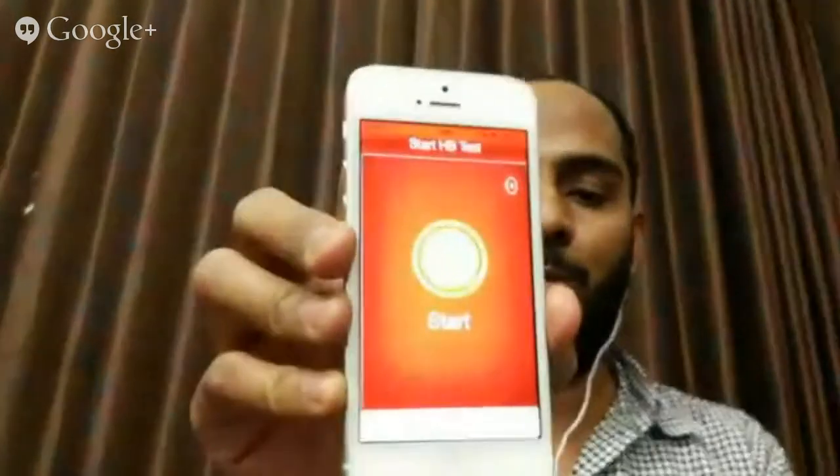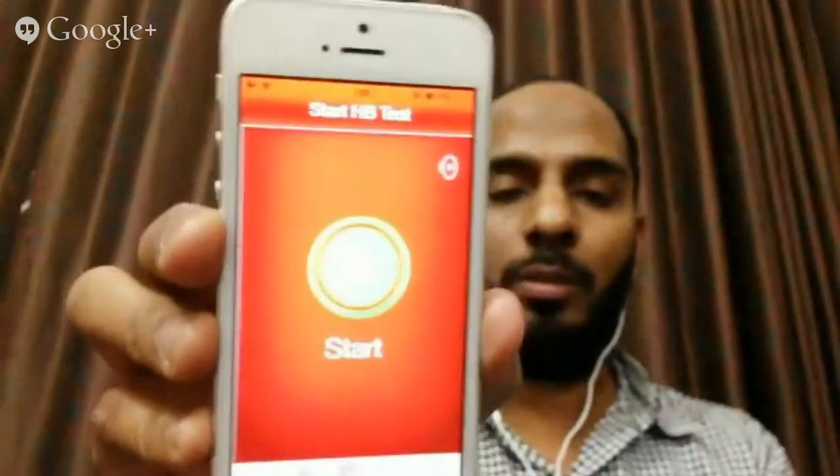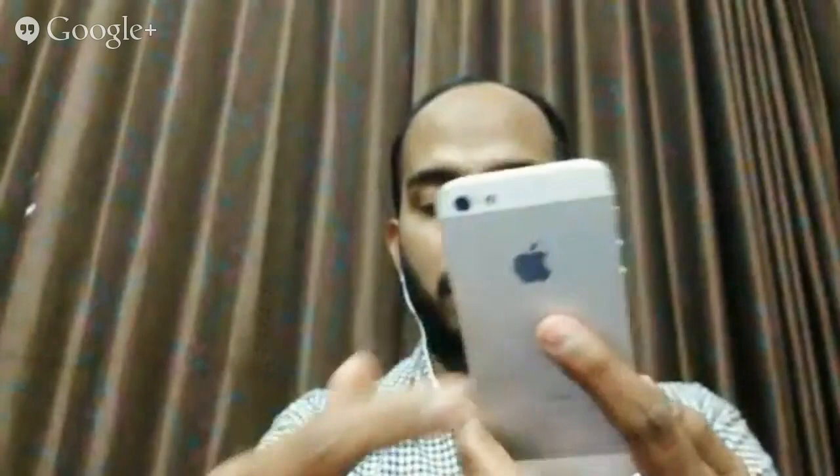Here I'm with my Apple iPhone 5. On this Apple iPhone 5, we are going to see this is the splash screen of the app, and this is the main start screen of the app. You have to keep the phone in your left hand and use your right finger, so that it covers the camera and flash.